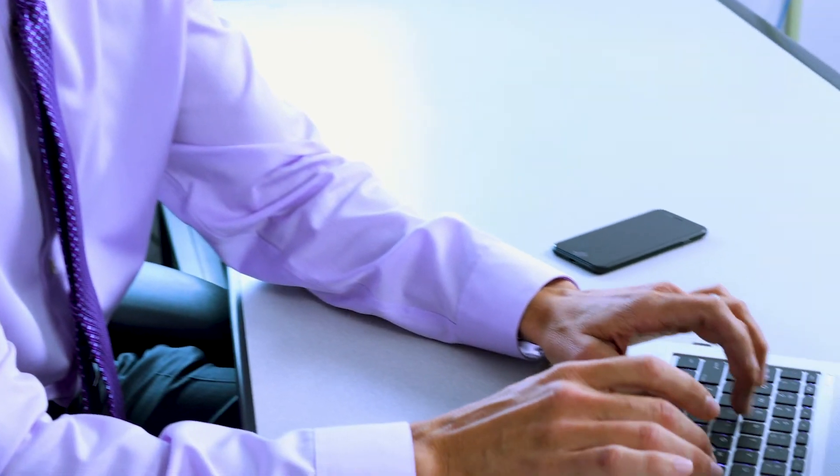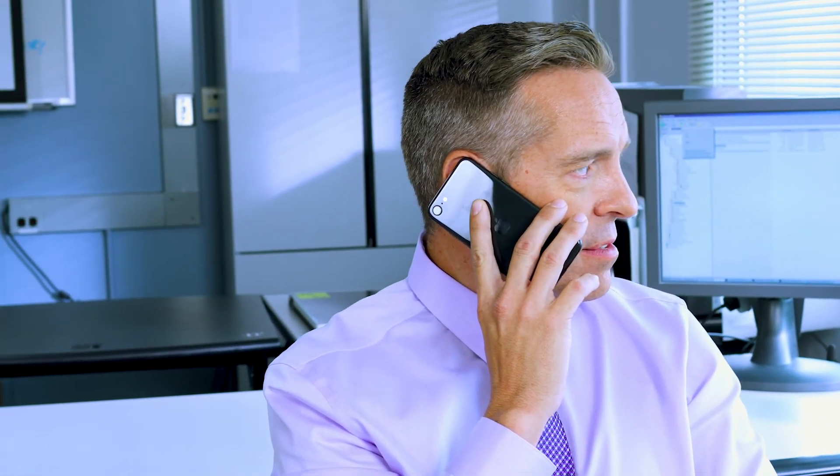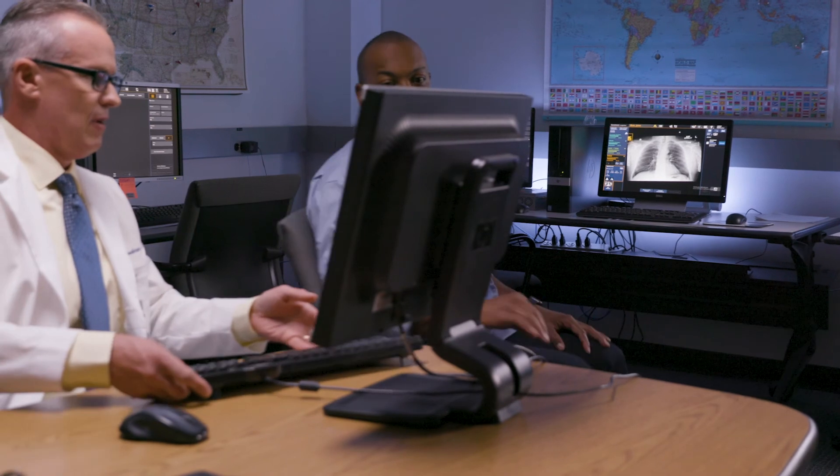Cybersecurity is a huge concern and it's getting to be a bigger threat all the time. Last year, our hospital diagnostic laboratories had a data breach that exposed the personal information of thousands of our patients. Since then, we've taken multiple steps to secure our hospital network, including working with all of our suppliers. CareStream's image view software uses Windows 10, which adds protection and can help prevent malicious cyber attacks and protect our patients' sensitive information. Now that's peace of mind.